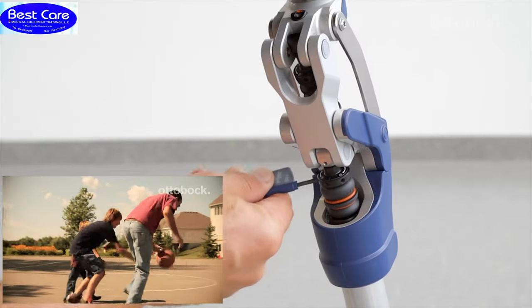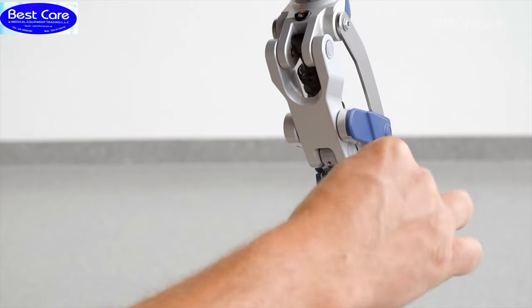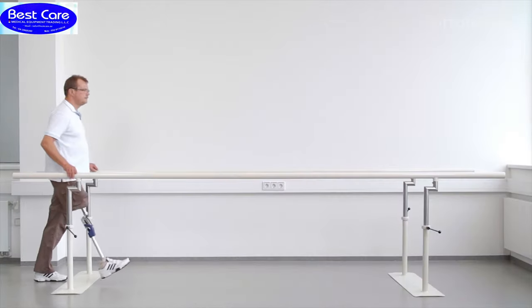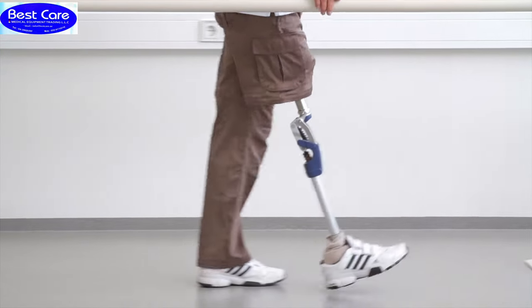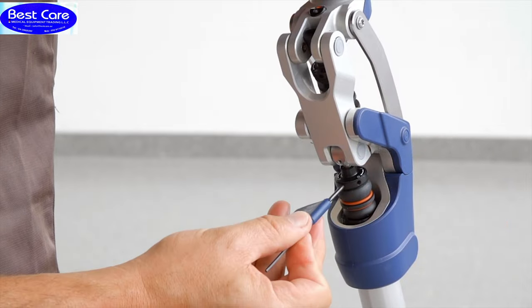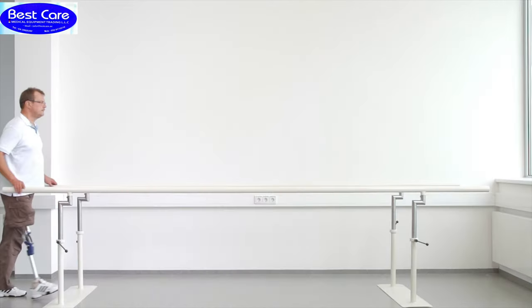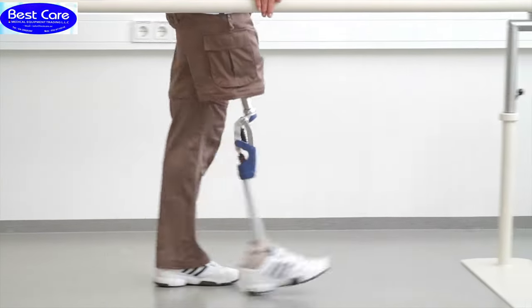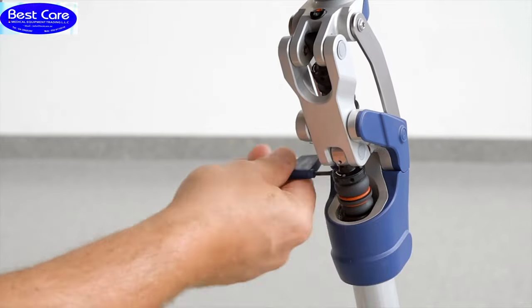Knee flexion is controlled at heel strike by an adjustable elastomer element, and stance phase flexion is in the range of 0 to 10 degrees. At this point, the EBS unit has too much pretension, which leads to no stance phase flexion. The user will have difficulty moving through stance phase since the prosthetic foot is relatively far in front. Please decompress the EBS unit a bit so that the user experiences a more comfortable heel strike and can walk with more comfortable stance phase flexion.